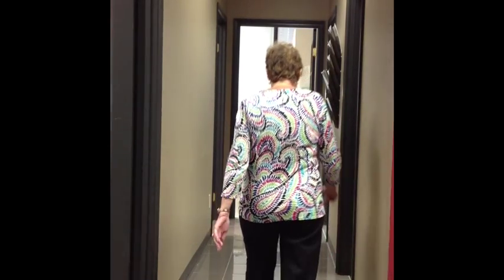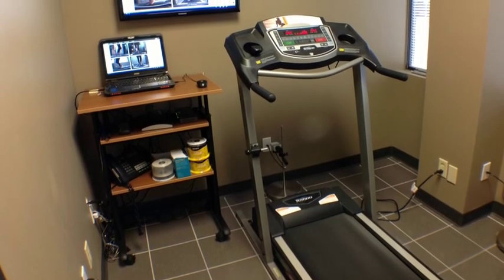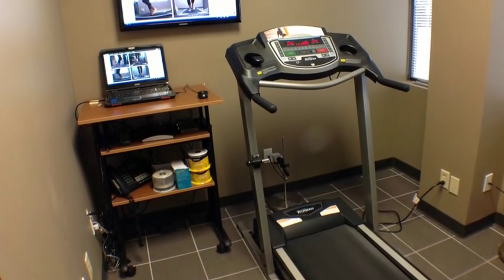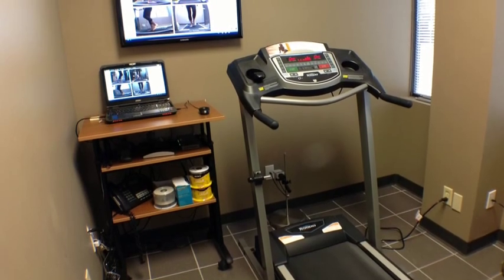In the past, gait analysis consisted of observing our patients walking in a hallway. Although this provided us with plenty of useful information, it does become more difficult to see details as patients attempt to walk faster or run in the hall. We also found it difficult to explain what we saw to the patients.